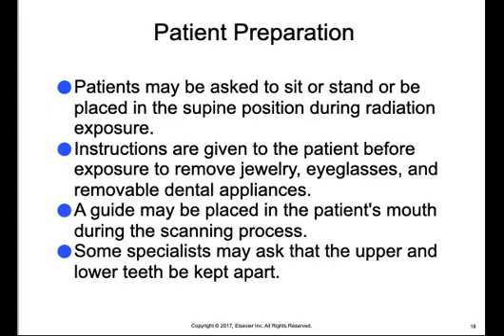Also, a guide may be placed in the patient's mouth during the scanning process, because some specialists might ask that the upper and lower teeth be kept apart. That guide is designed to do that, and they'll do it in the correct measurements that the machine requires.